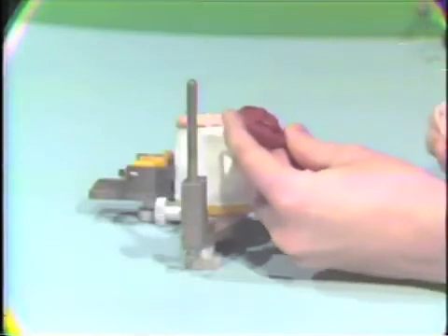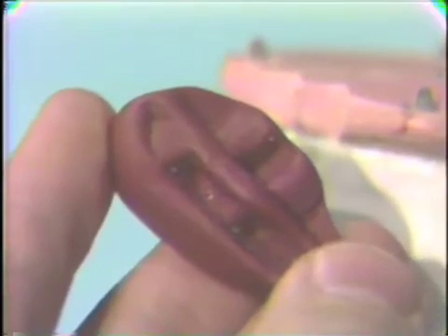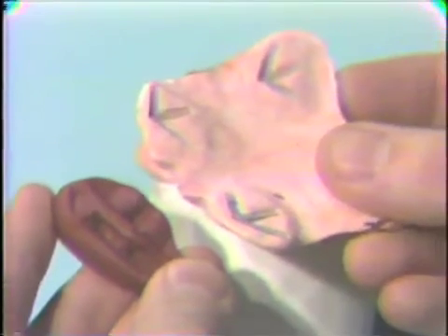Once we've completed mounting the maxillary clutch, we can begin the mounting of the mandibular clutch. In this procedure, we'll use our little compound jig that we fabricated just following the second stereographic recording. As you can see, the little notches in the compound correspond to the little notches in the anterior part of the clutches.